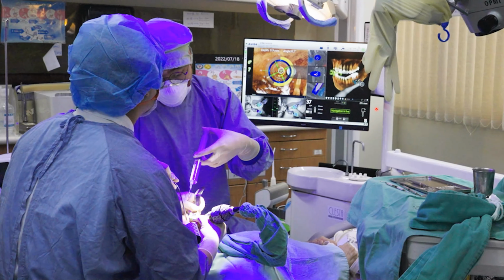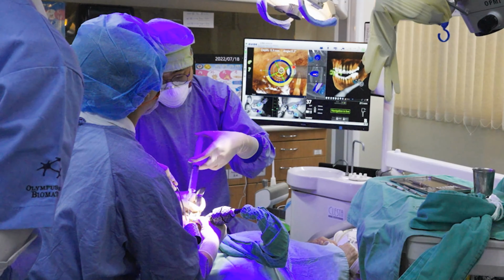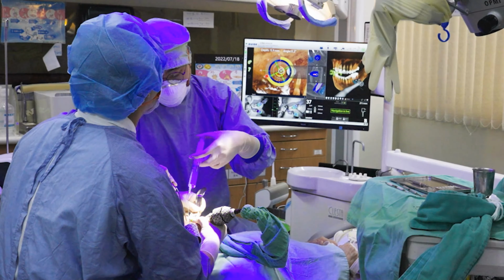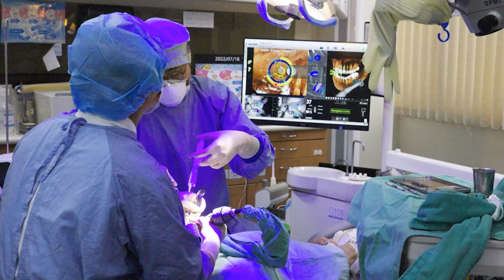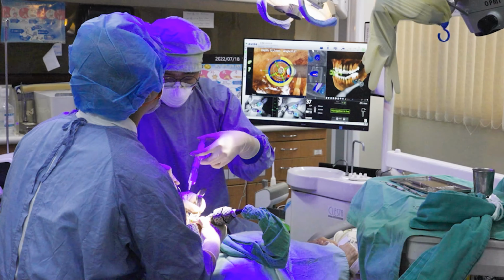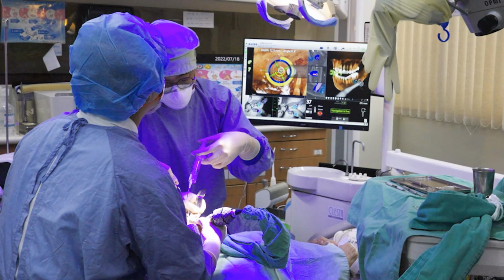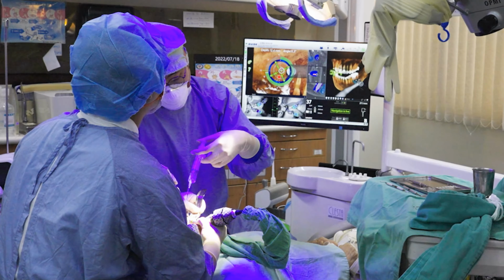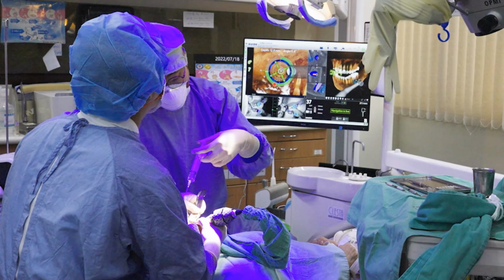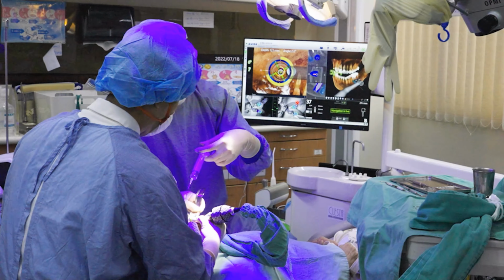So here I'm performing the apical surgery, where we can see the bar here is going yellow, and it will go green and then red. When I reach green, it means I'm in position. And when I reach red, it means I'm over. So as you can see, I'm drilling. Oh, it reached green. So that means I'm almost there. And if I go through that, it will go red. Yeah, that means I'm over.